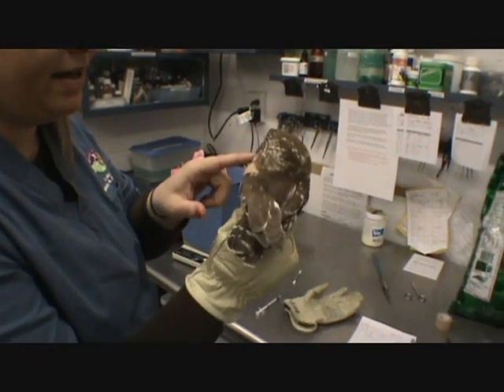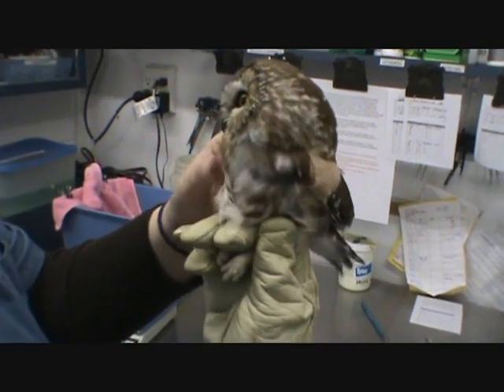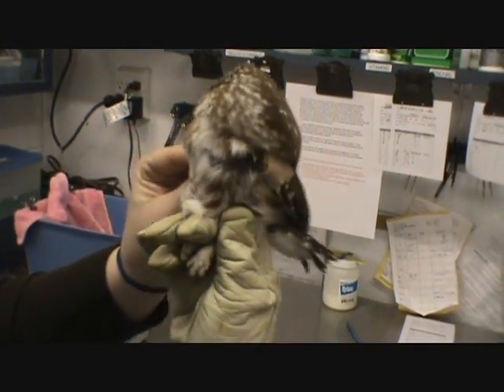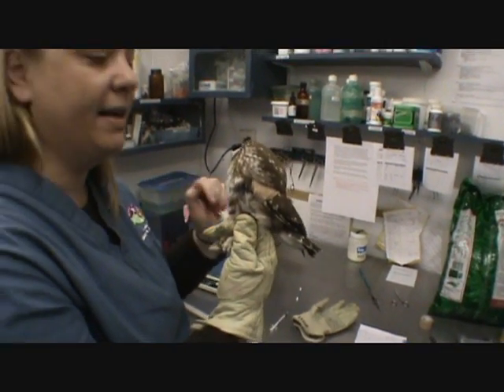We have a nice wing wrap on — a figure eight wrap supporting the wing to stabilize the fracture in that bird's wing. In about five days we'll check that wrap and see how it goes, and every day we'll check to make sure it's not too tight or doesn't get wet.